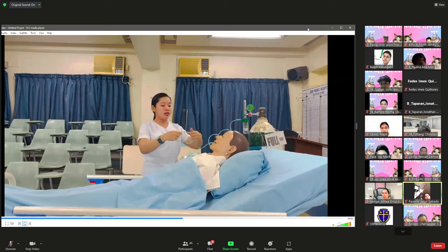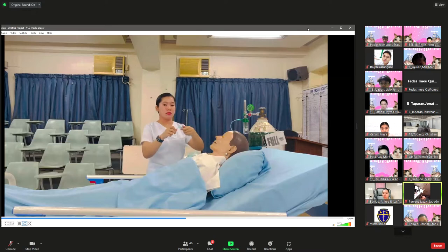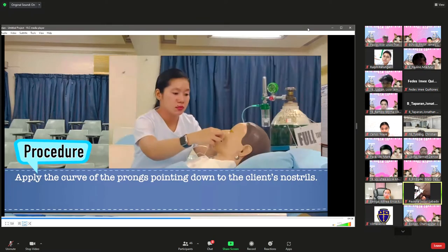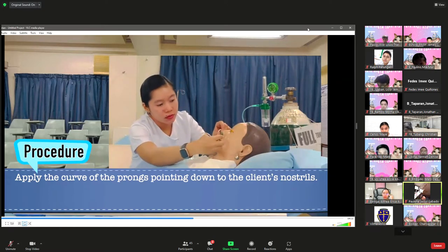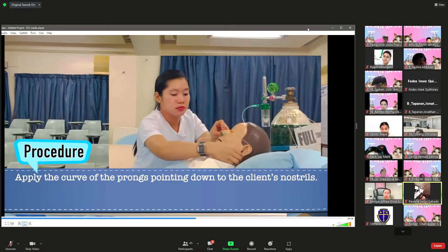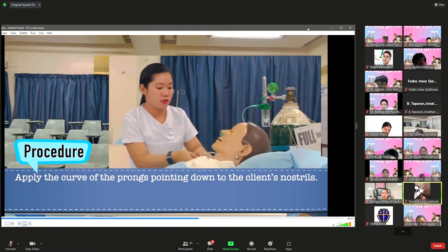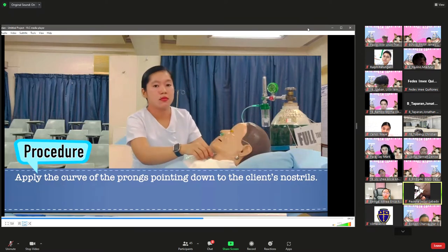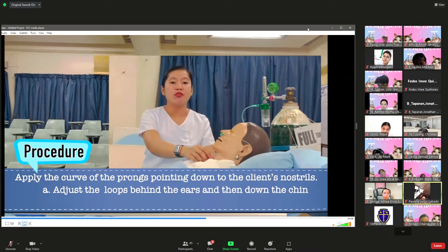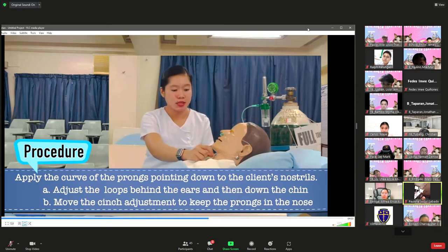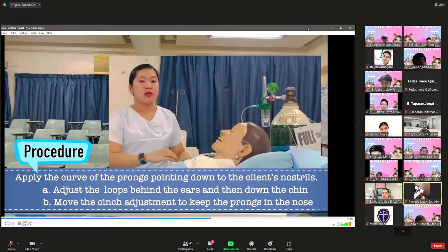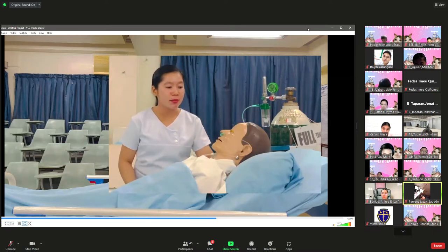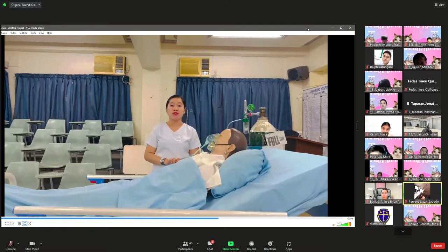Attach the nasal cannula to the client. Apply the curve of the prongs pointing downward into the client's nostrils. Adjust the loops behind the ears and down the chin, then move the slide adjustment to keep the prongs in place. Instruct the patient to breathe through the nose while keeping the mouth closed — keeping the mouth closed provides optimum delivery of oxygen to the lungs.